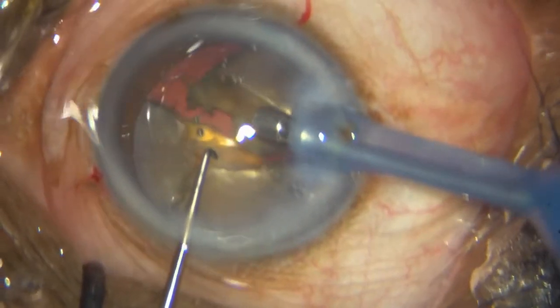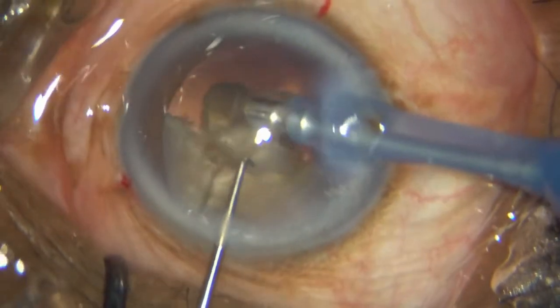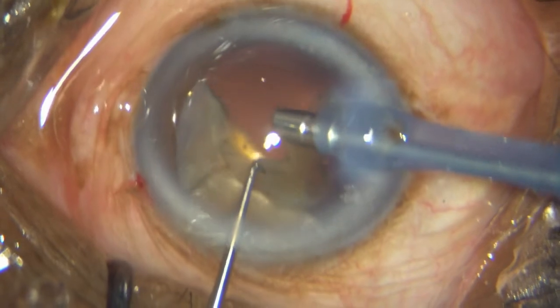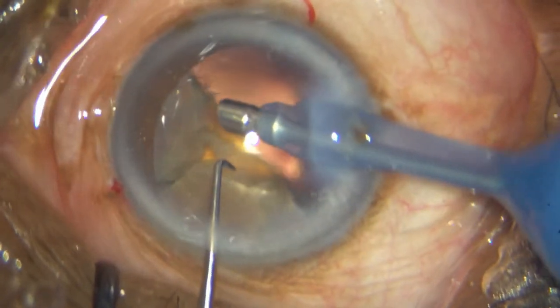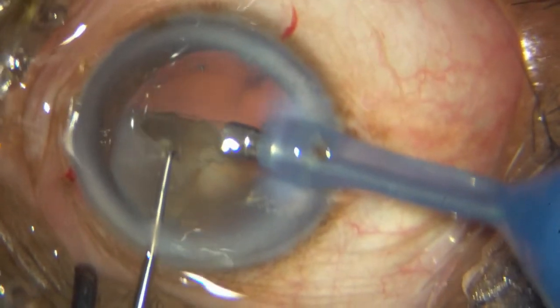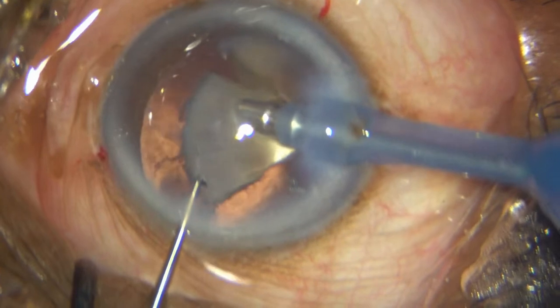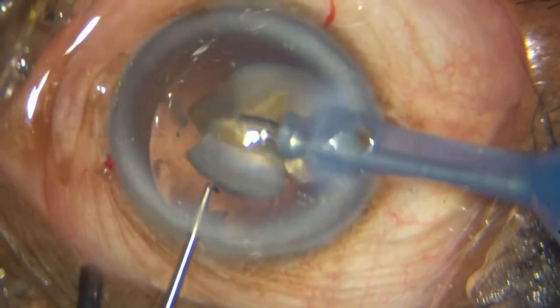Controlling the other hemi-nucleus, keeping it within the bag, not allowing it to come out. Watch how I handle this — I bring out this hemi-nucleus, let go of it, and tip it with my chopper to get at that central attachment. It makes it much easier to handle it piece by piece.